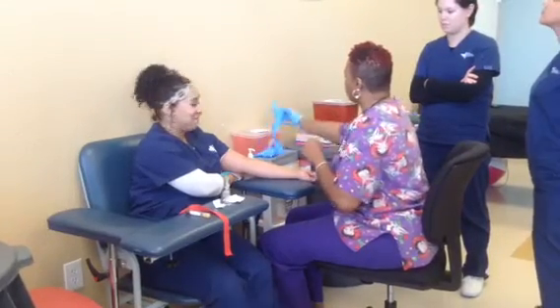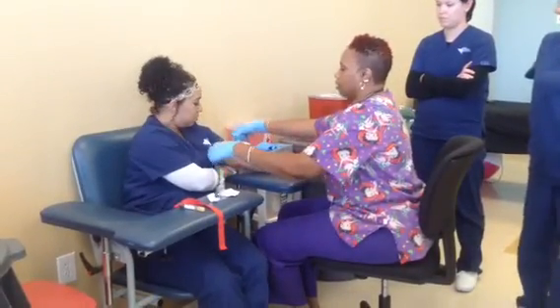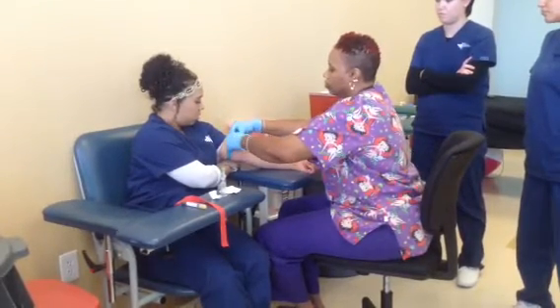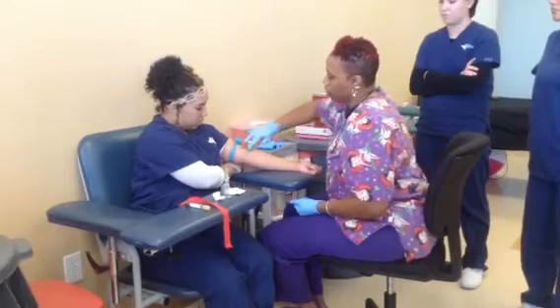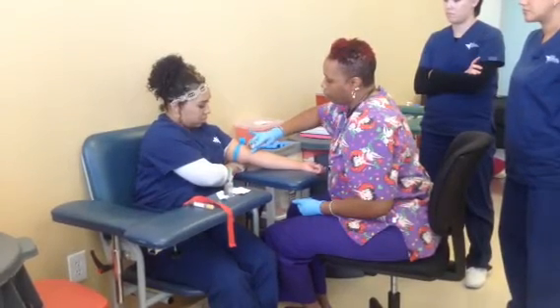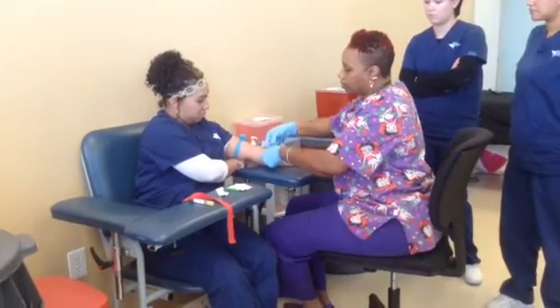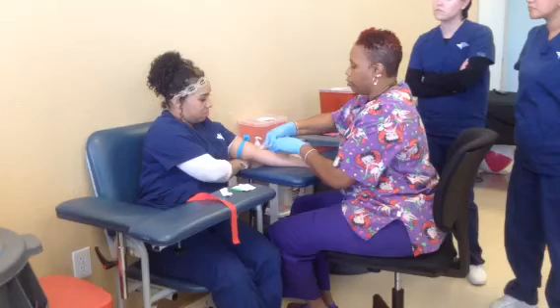I'm going to put my gloves on. I'm going to re-tie my tourniquet — want that to be nice and snug. Tourniquets restrict venous flow, allow arterial. If I want to repalpate, I have to touch my finger to the alcohol and repalpate my site. I'm going to let that dry so we don't have hemolysis. I'm going to anchor back, stick quick, relax my fingers, and put my tube on.